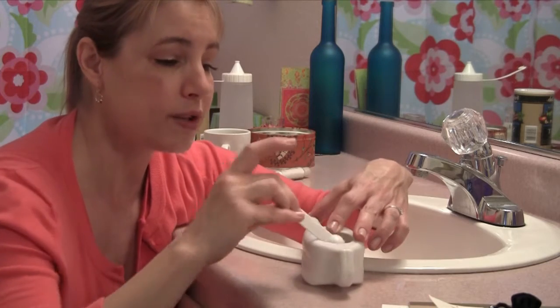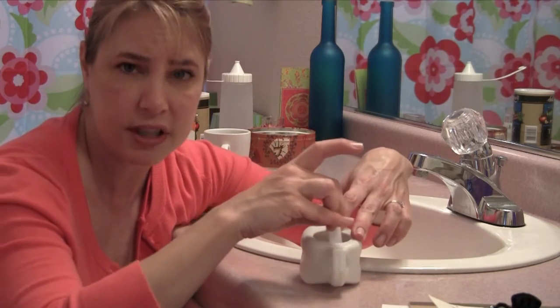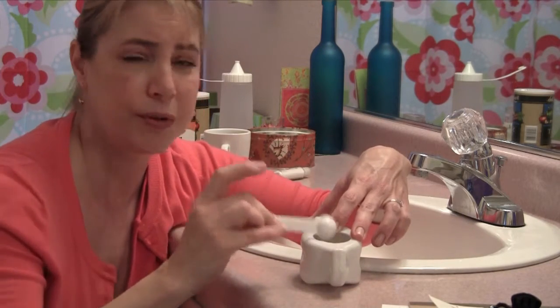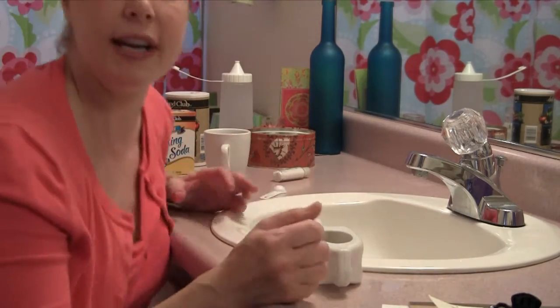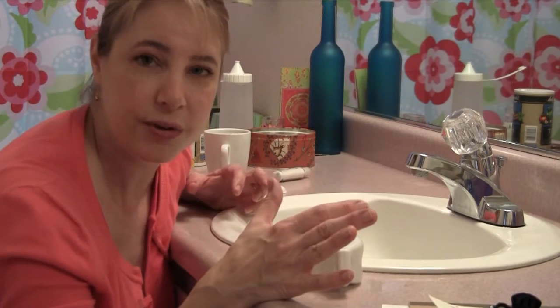Okay, so I mix this all up. So the baking soda is in here and the salt is in here. Hopefully I got the proportions right, because if it's wrong, it's going to burn like crap. So there's that. Okay, so now I'm going to stand up and kind of lean over the sink.